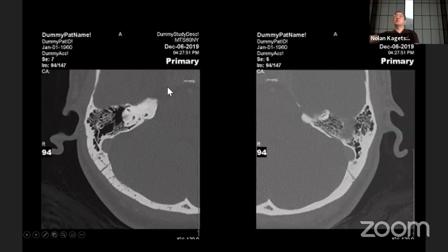This is a patient. For HIPAA purposes, it comes out as a dummy patient name, so we're not trying to be insulting or anything. And this is an interesting patient that had tinnitus. So this is another case. These are CAT scans. And one of the cool things about radiology is that you develop a search pattern. And this is the temporal bone, the so-called petrous pyramid. And you can make out some of the anatomy. These are semicircular canals. This is the top of the superior semicircular canal.